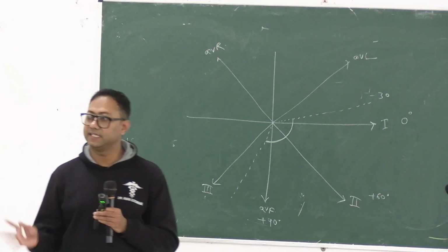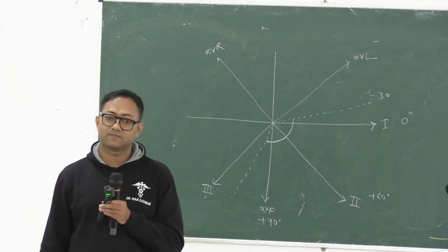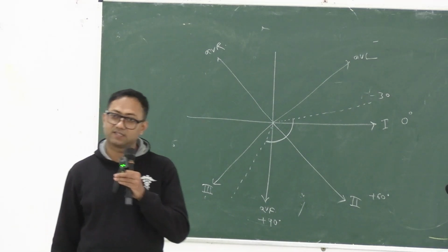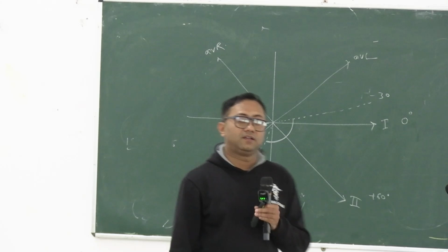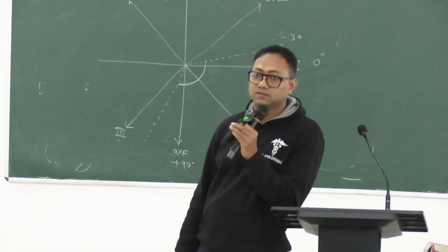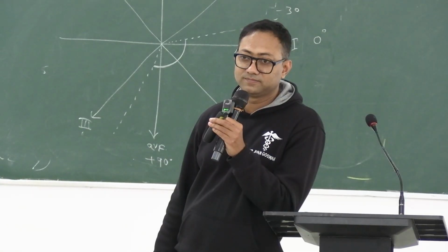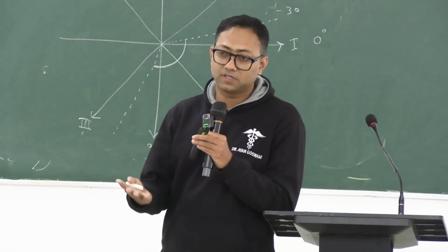What is the mean electrical axis? May I ask you, what is the mean electrical axis? Do you remember the vectors? No. At least look and tell me.